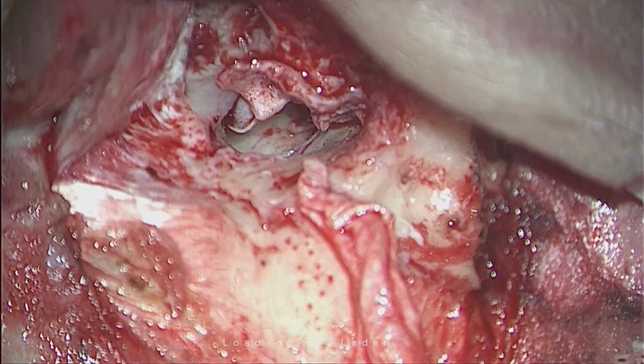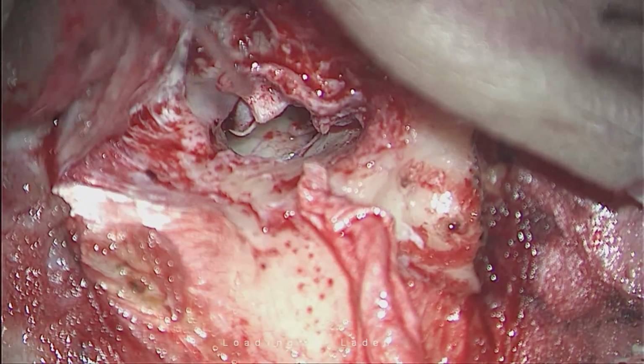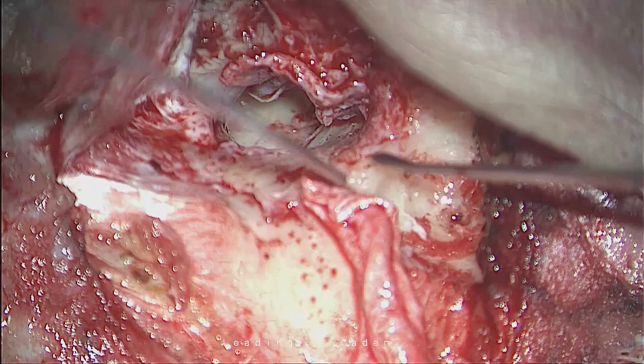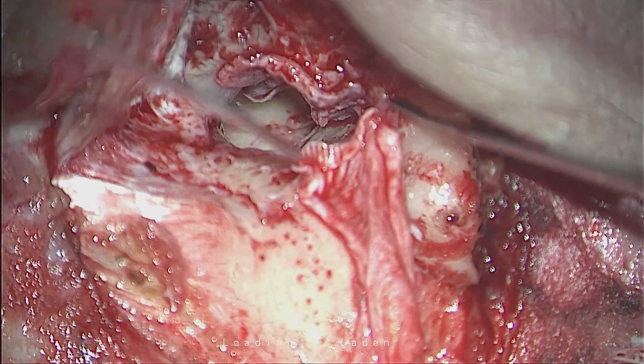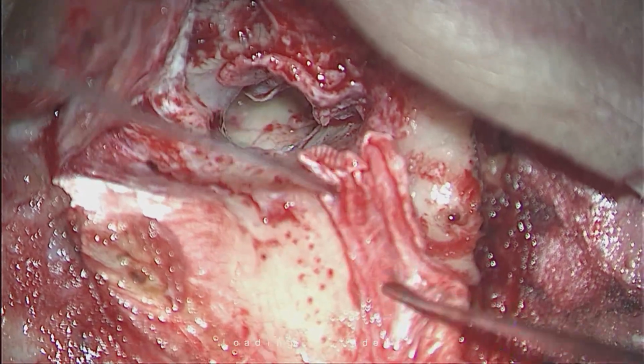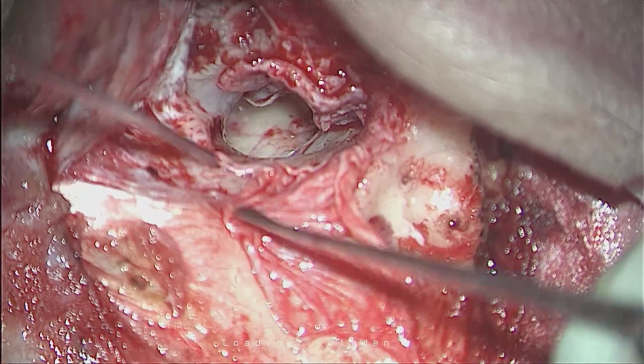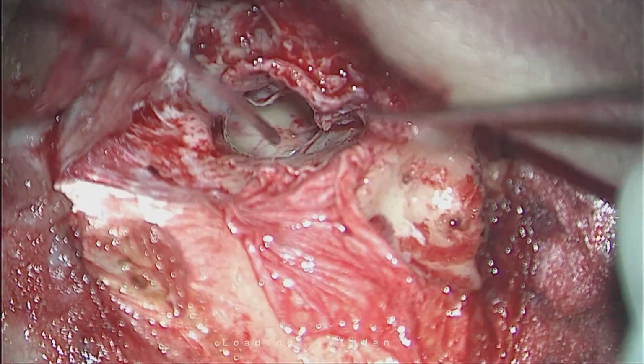Now see, our graft bed is ready to accept this graft, and this graft I have elevated from the bed. I am going to place it on another bed. Can you see? Yes, sir. This is fresh graft. That's the beauty of the fresh graft. Believe me, this is much easier to handle.